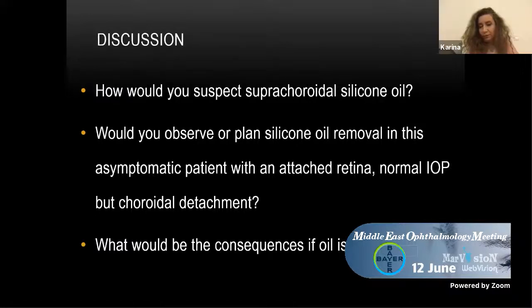Particularly when we are using this angle, we have a trocar cannula system where we are not suturing. When you want a self-sealing sclerotomy, you have a tendency to go more oblique. If you are partly in the suprachoroidal space and partly in the vitreous cavity, you think fluid is flowing inside the eye. But when you inject, probably you are partly injecting silicone oil in the suprachoroidal space also. That is one part of it.